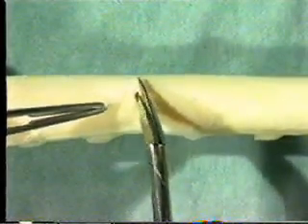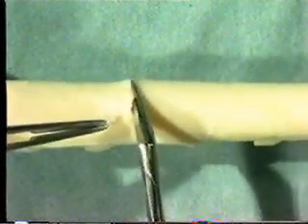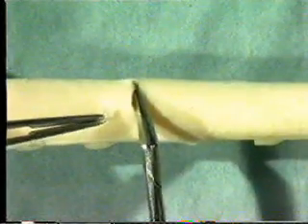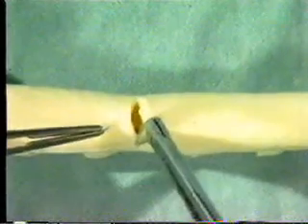Then complete the arteriotomy using angled pot scissors. Aim to open the vessel to between one third to one half of its circumference, depending on how much access is required.